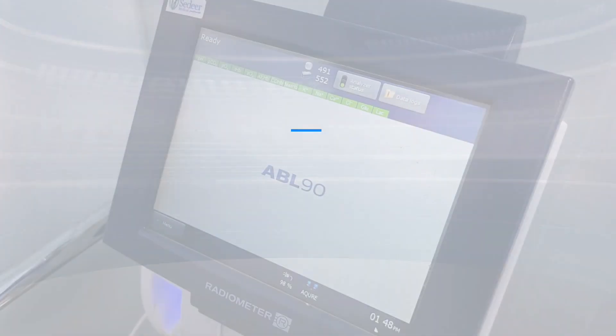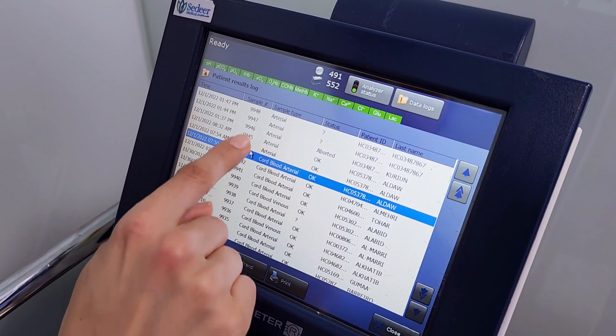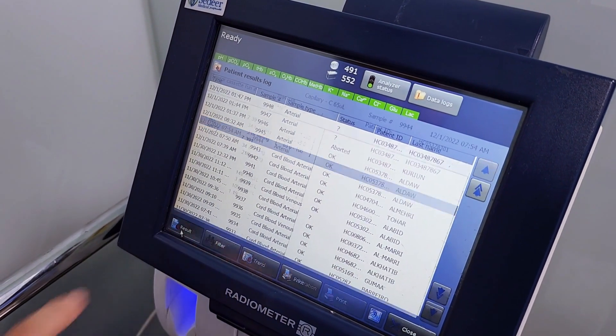To review a patient's results, press data logs and tap patient results log. Choose the patient's data needed and press results.